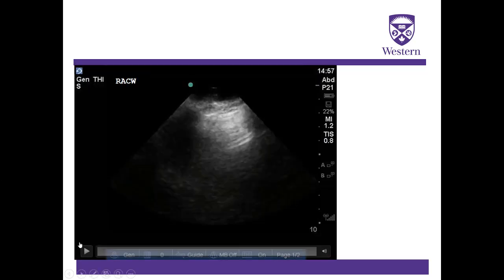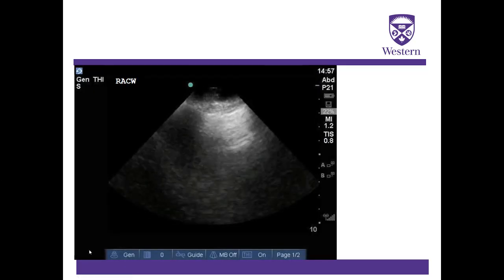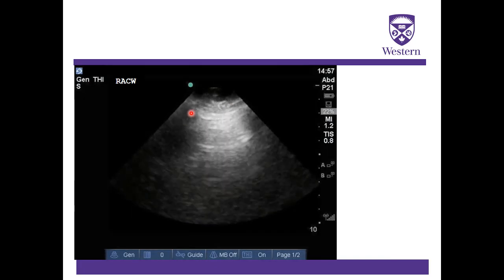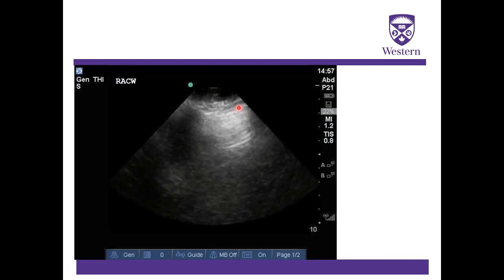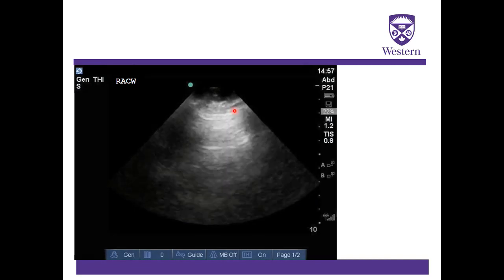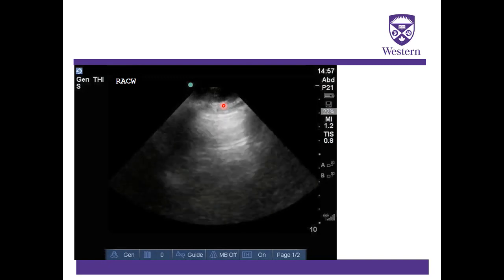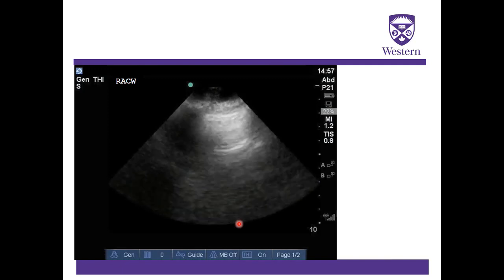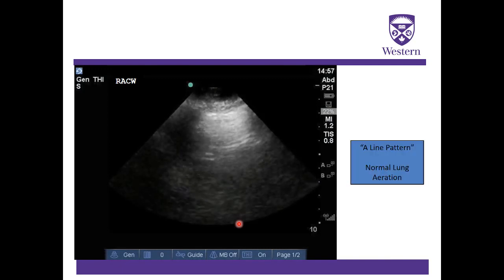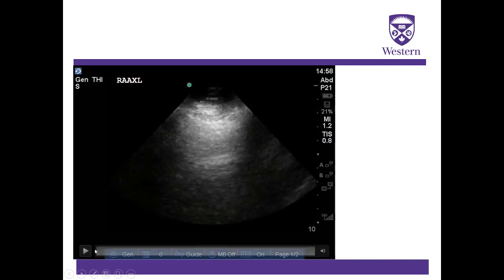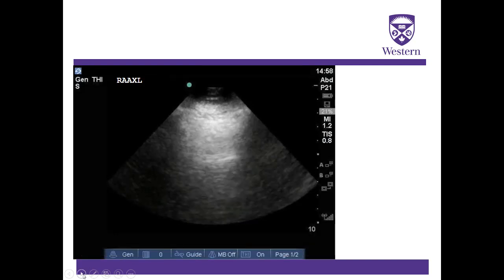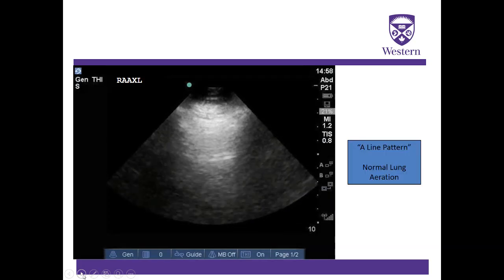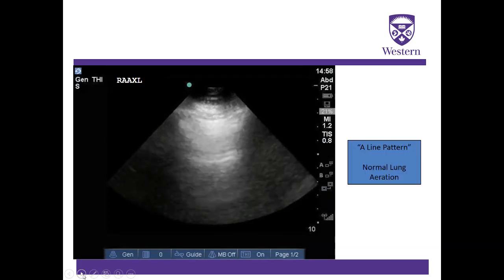Moving to the right lung, in the right anterior midclavicular line we see something quite different than on the left. We still have a normal shimmering pleural line ruling out pneumothorax, but rather than B-lines, we have A-lines, which is indicative of a normal aeration pattern. The right anterior axillary line shows the same finding — an A-line pattern suggesting normal lung aeration.